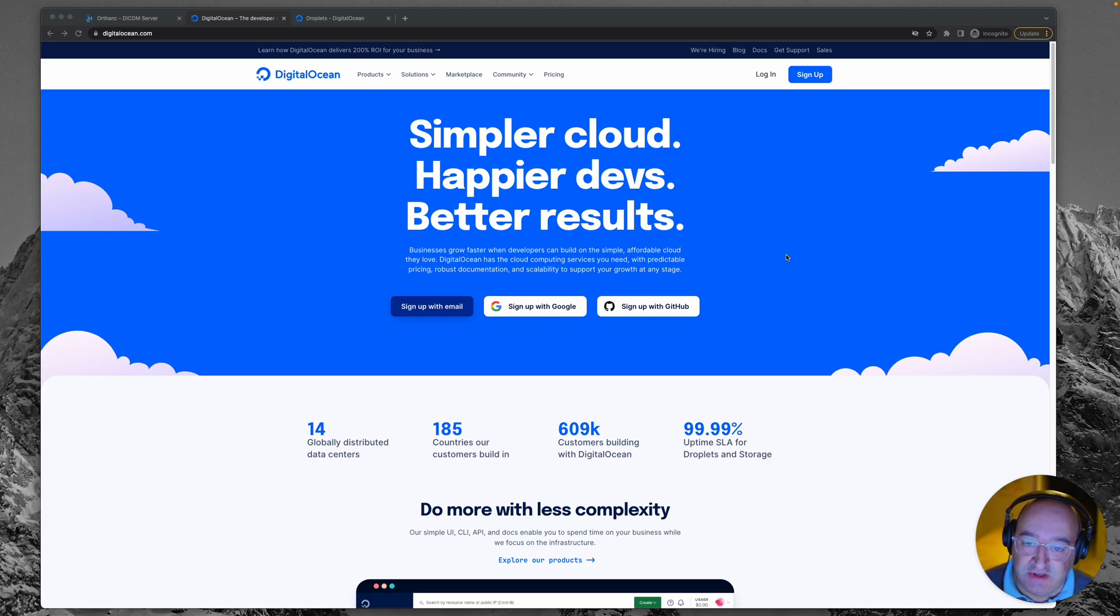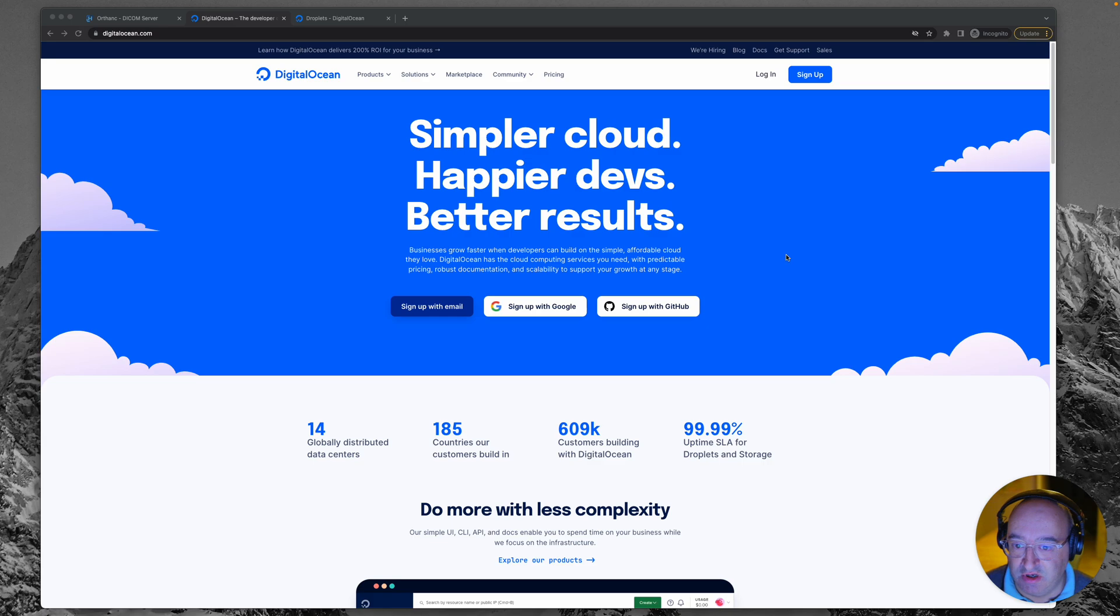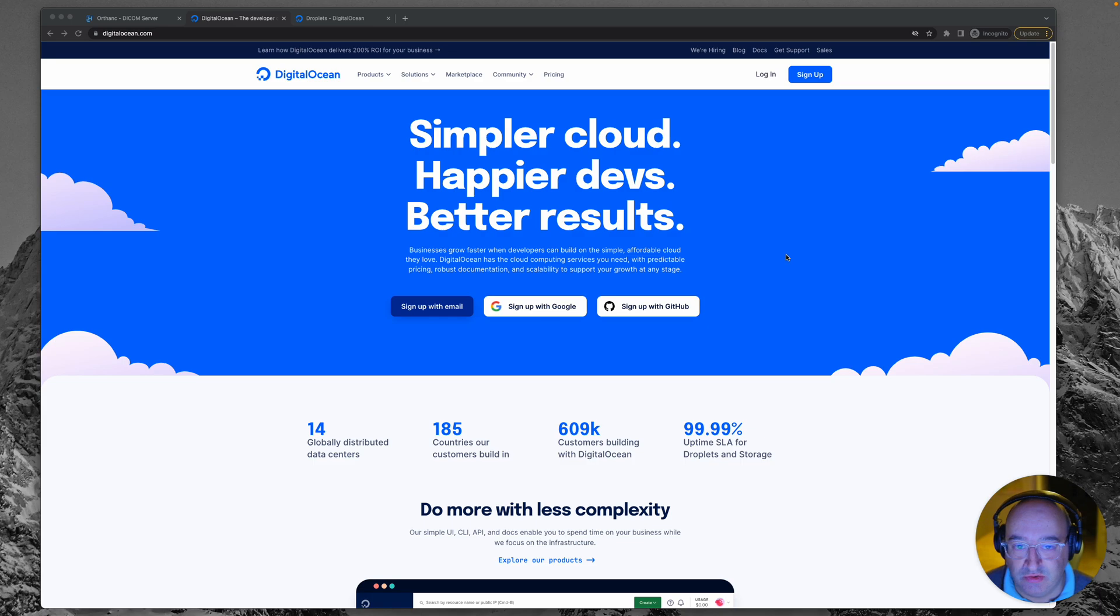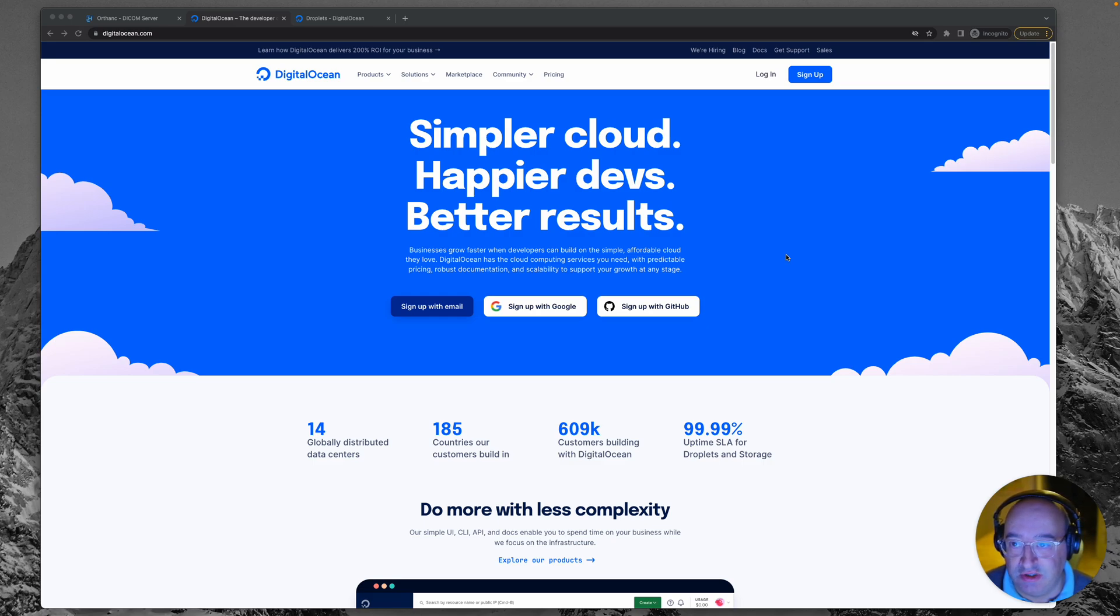So in this episode, we're going to cover how to get a virtual private server and set one of those up. DigitalOcean is my suggested provider if you're new to all this. Other good providers include Linode and RackNerd, but let's go with DigitalOcean for this demonstration.